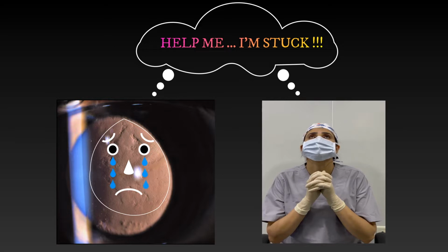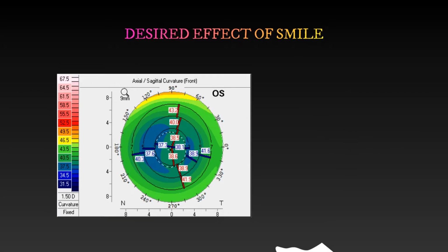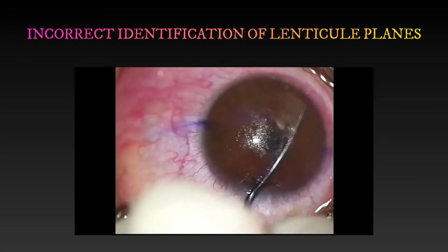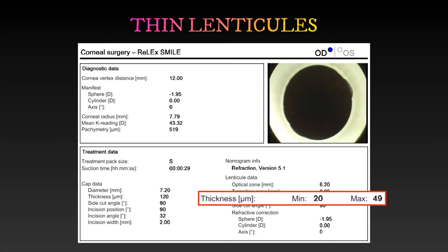In this video, we discuss the various management strategies to manage retained lenticules in order to induce the desired effect of the primary SMILE procedure. Retained lenticules or their fragments may chiefly occur due to incorrect identification of lenticule planes, improper technique of dissection, black spots and dense opaque bubble layer, and thin lenticules.